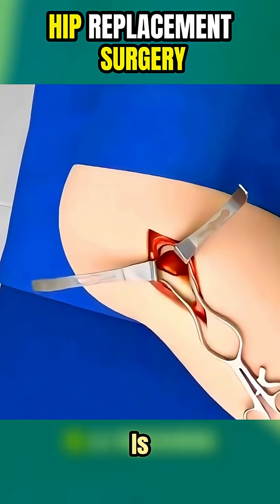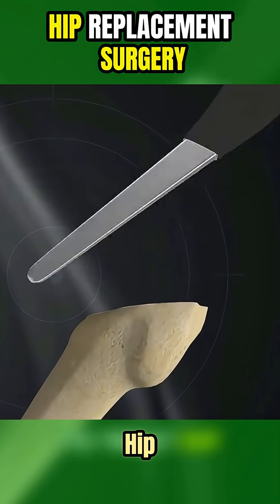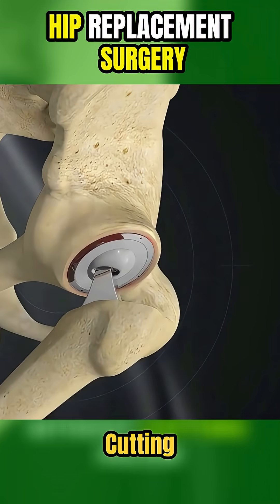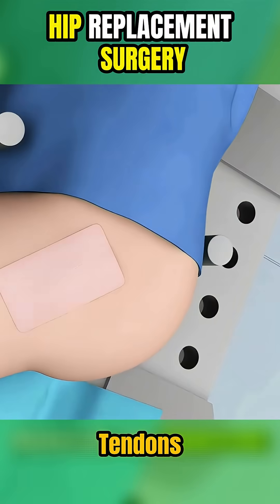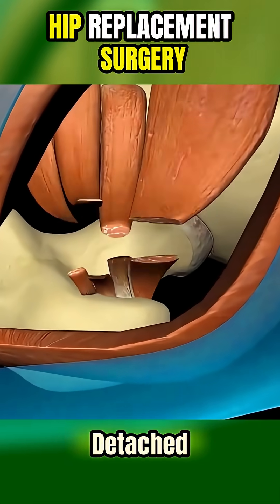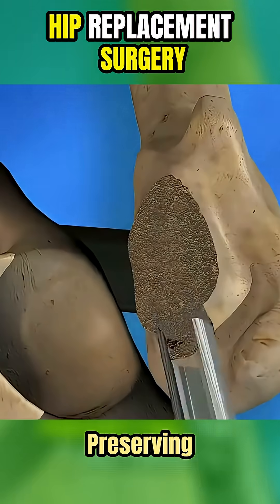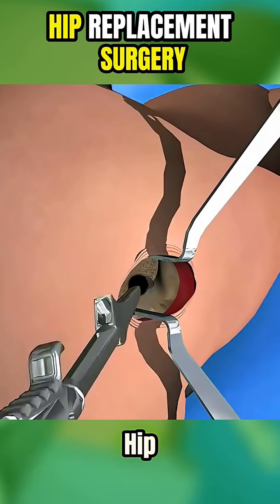SuperPath hip replacement is a modern, minimally invasive technique to treat hip joint damage without cutting major muscles or tendons. Unlike traditional hip replacement, where muscles are detached, SuperPath allows the surgeon to work between the muscles, preserving the natural structure of the hip.